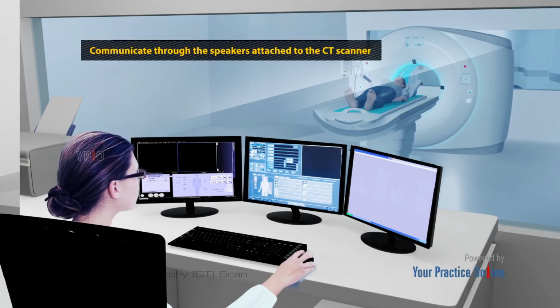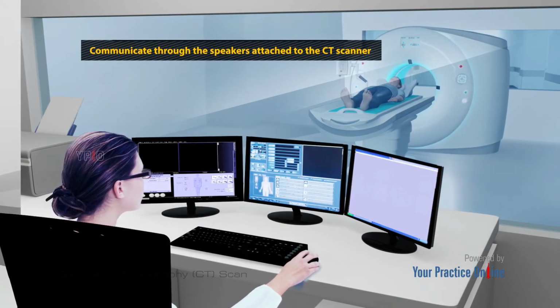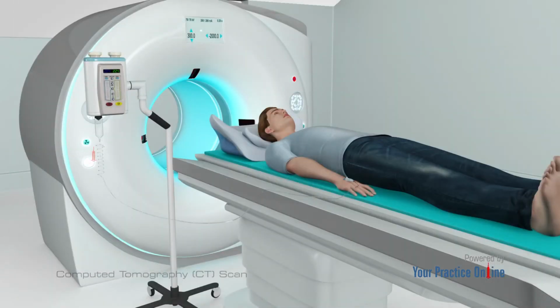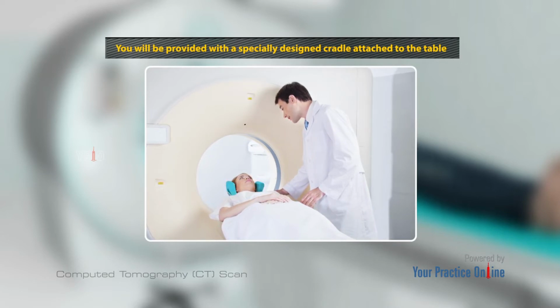You will be able to communicate with the doctor or technician through the speakers attached to the CT scanner. CT scanners generally resemble a large donut with a motorized table that slides in and out of the scanner, with straps and pillows to comfortably prevent movement during the test. For head scans, you will be provided with a specially designed cradle attached to the table to hold your head in place during the scan.